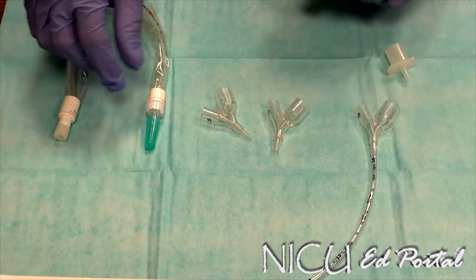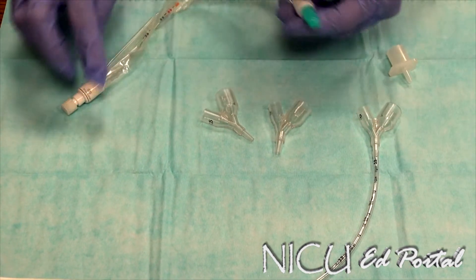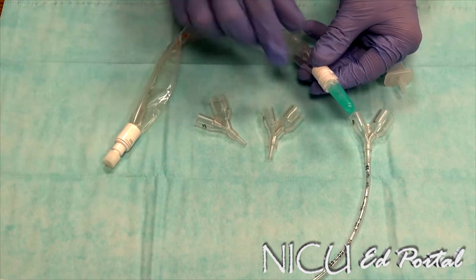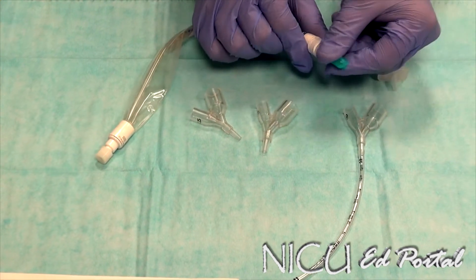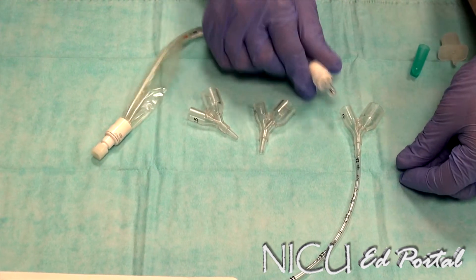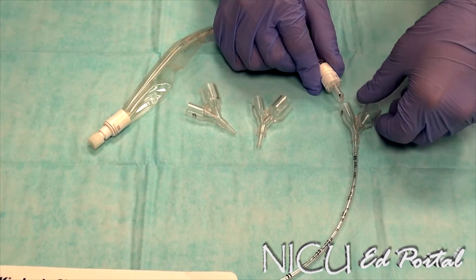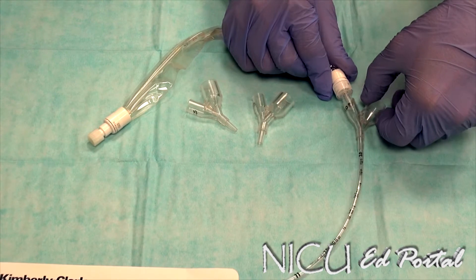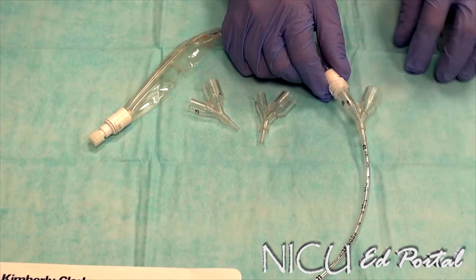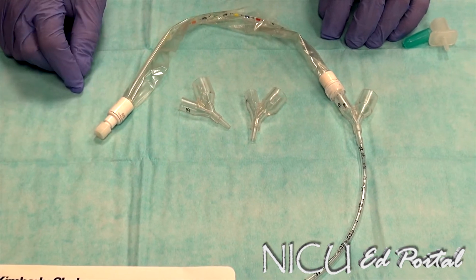From here, we take our 5 French catheter, remove the blue cap, and this catheter goes in the smaller of the two ports. And now you are ready to administer your surfactant.